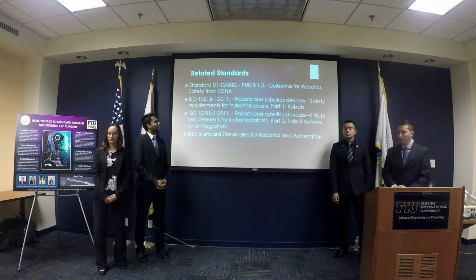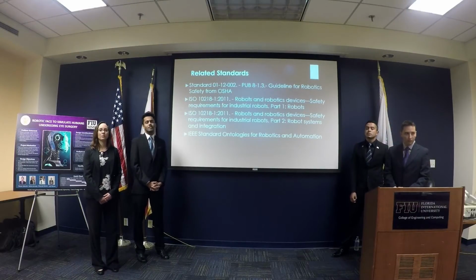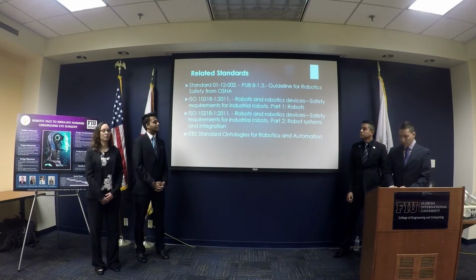These are some of the related standards which we will be continuously referencing throughout the manufacturing of this project. Some of them are OSHA, ISO, and IEEE.